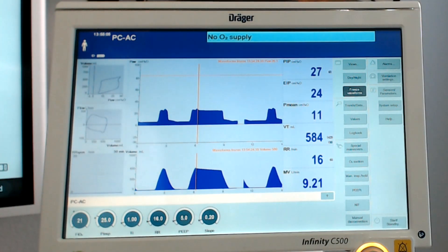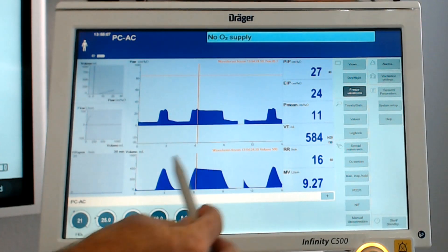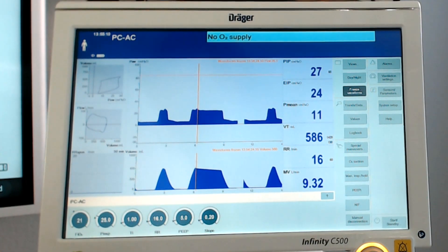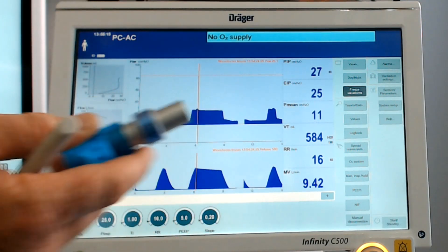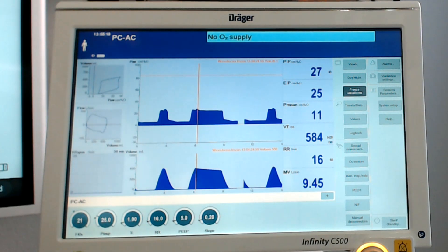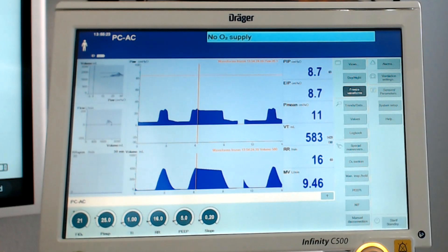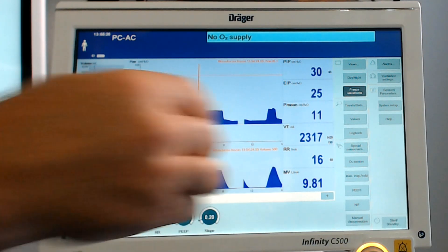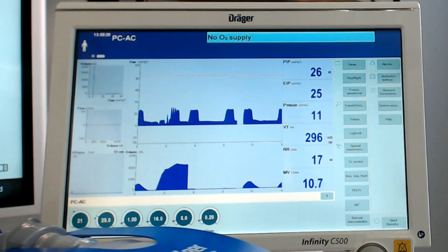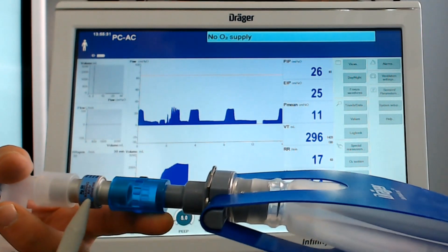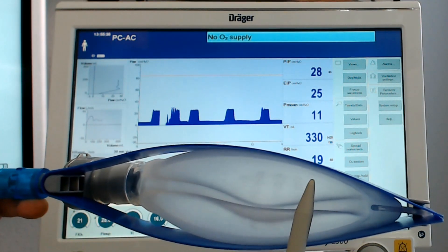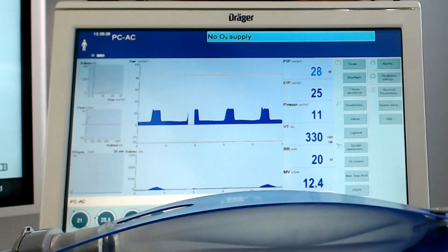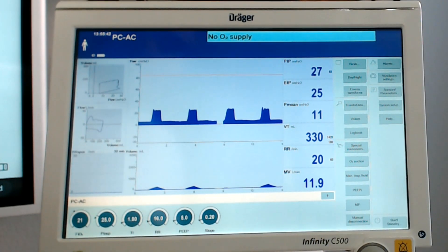If you've been paying attention, the only thing that's changing is the amount of volume that's being delivered. Just like I did in the volume control video, I'm going to put this piece in line with my ventilator - this is going to simulate an increase in airway resistance. I have now put this airway resistance simulator in line, and we need to go back to baseline. I'm putting my one rubber band back on to make sure we're starting from exactly baseline.